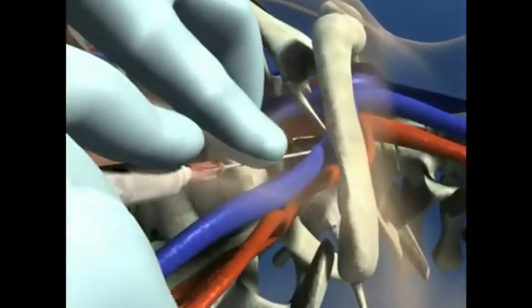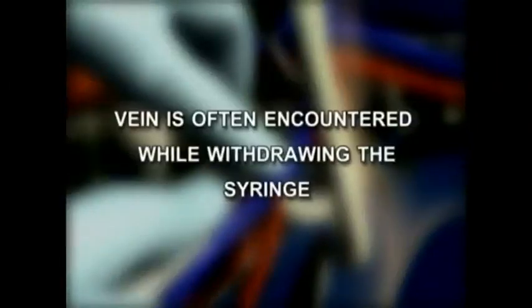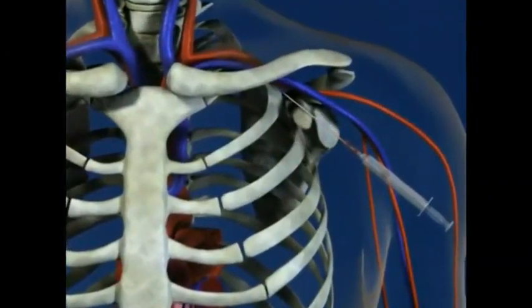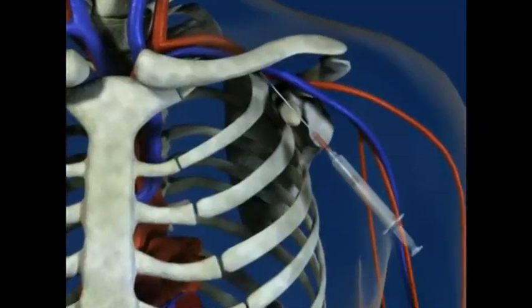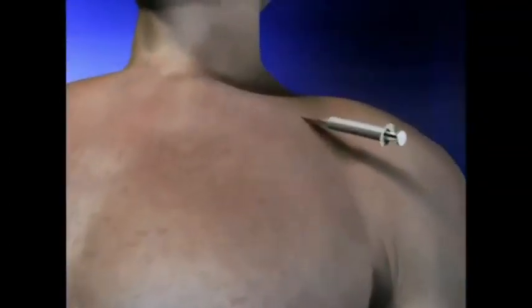If no flash of blood is encountered, the needle is slowly withdrawn, again while maintaining negative pressure in the syringe, as the vein is often encountered while withdrawing the syringe. If this is unsuccessful, repeated passes are attempted with slight changes in the orientation of the needle to find the vein. After accessing the vein, the syringe is removed and the backflow of the blood is observed.